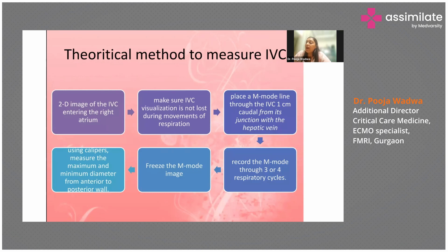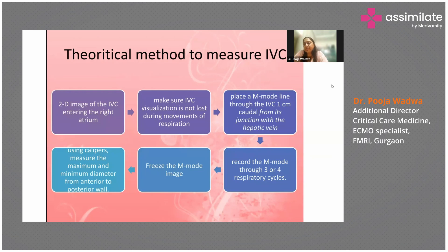The M-mode measurement should be taken ideally one centimeter from its junction with the hepatic vein. Your right atrium, IVC, and hepatic vein should all be present and appreciable in one view. When you are confident you can see them, place it in M-mode, record through three to four respiratory cycles, freeze that image, and use the calipers to measure the maximum and the minimum diameters.